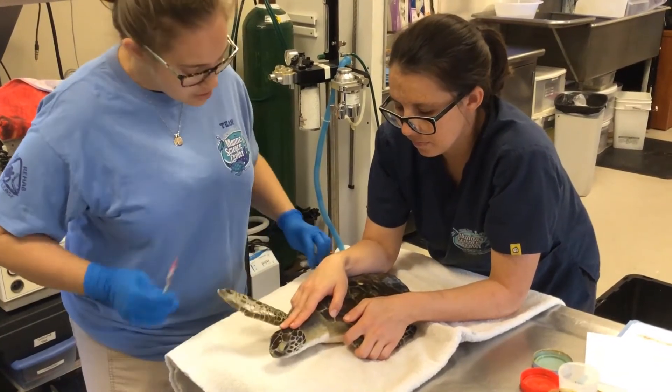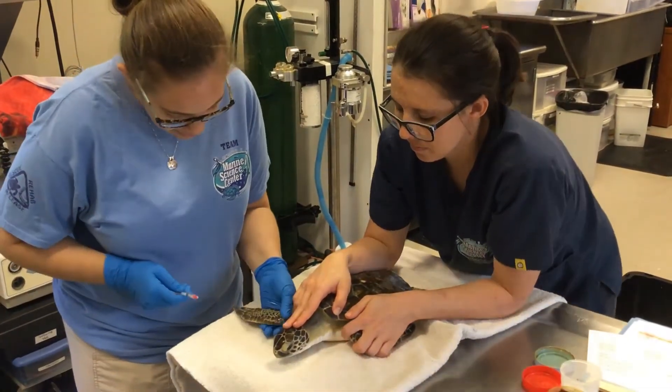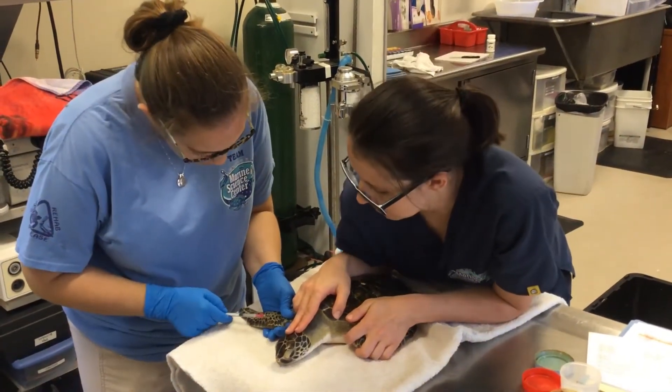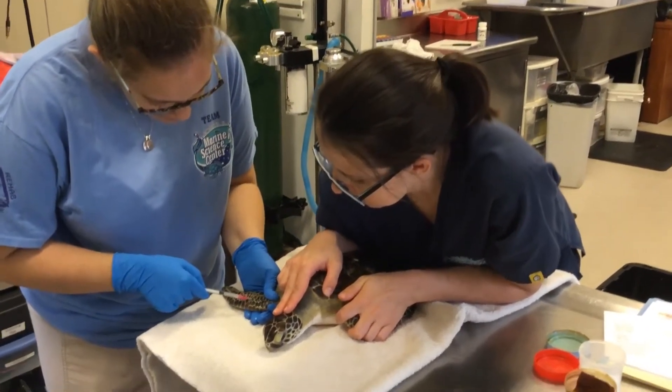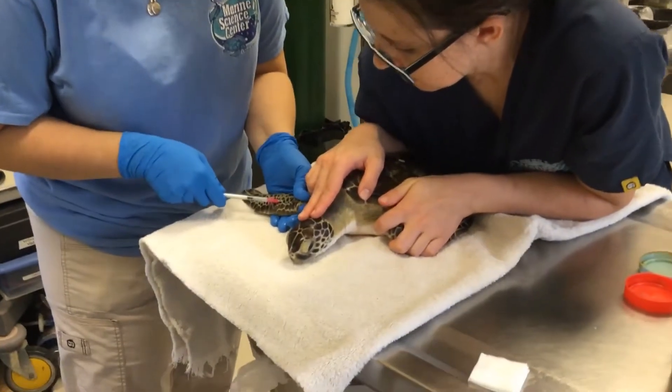What I'm doing right now is just giving him a little local anesthetic so this area of the flipper is numbed. So when we do the tagging portion, it's less bothersome for him.